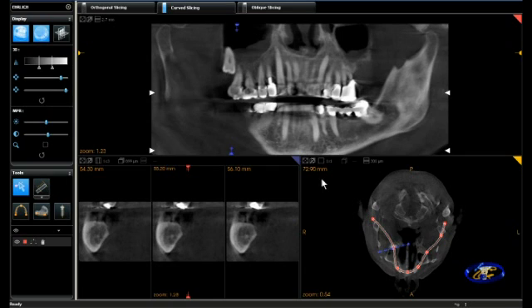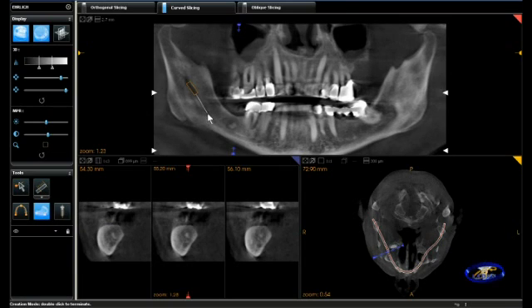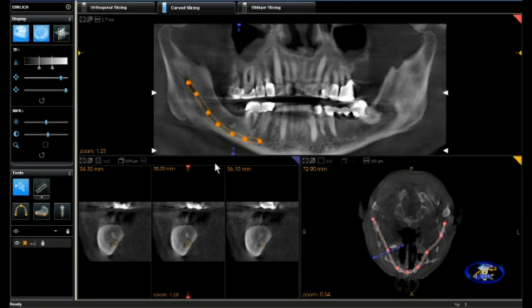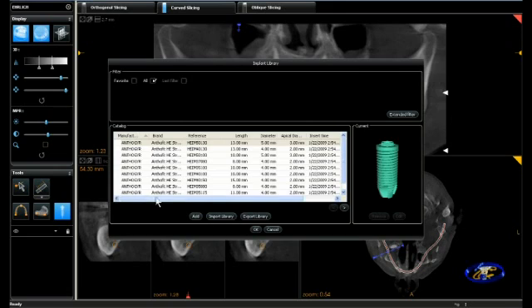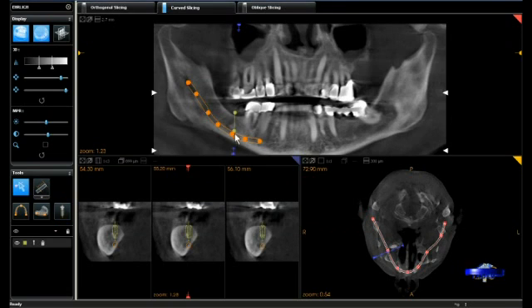Moving the cut plane again, we can see our third molar near the upper side. Visualizing a thin panoramic slice allows us to identify the nerve canal, and we can then mark it with an orange animation.